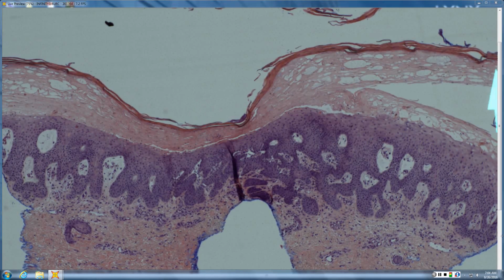And then this is epidermis, and it's just starting to necrose. So the upper half of the epidermis is necrotic, whereas the lower part is largely still viable. But there's not a whole lot of anything else going on. There's not really an infiltrate. There's nothing else that would seem to explain that necrotic pallor. Now, there's other things you'd want to think of in the differential. Is it reticular degeneration of like smallpox or something? Is this erythema multiforme or SJS or something of that nature? But there's a lot that goes against that.